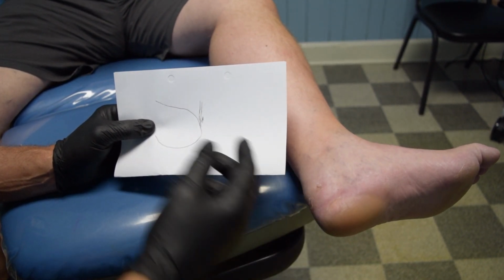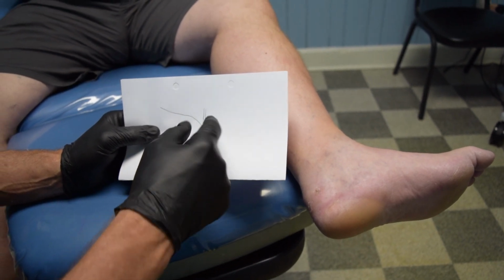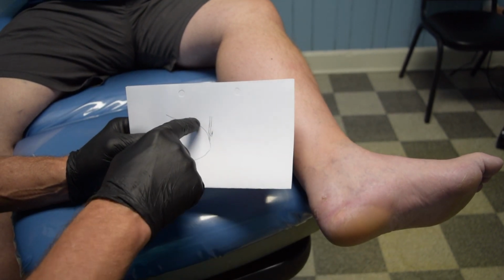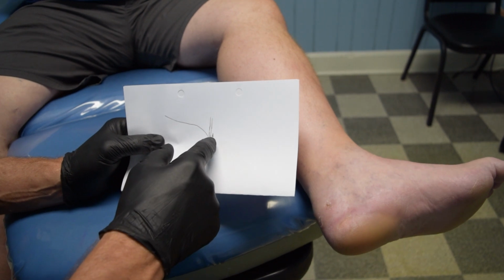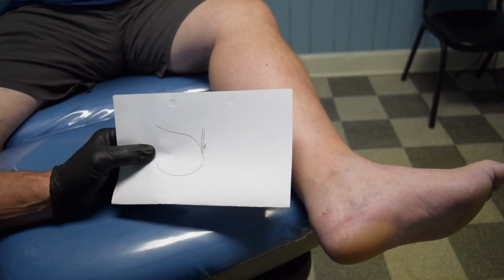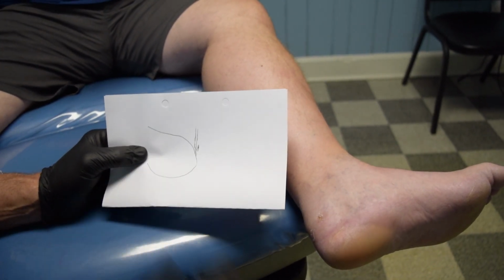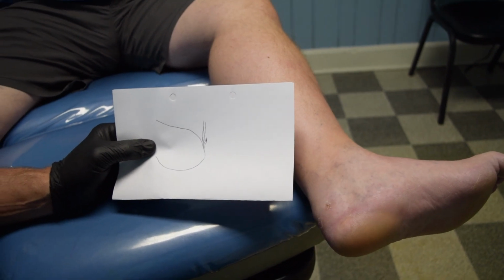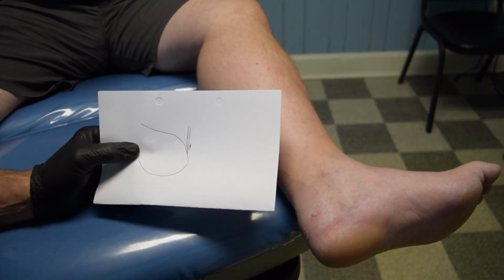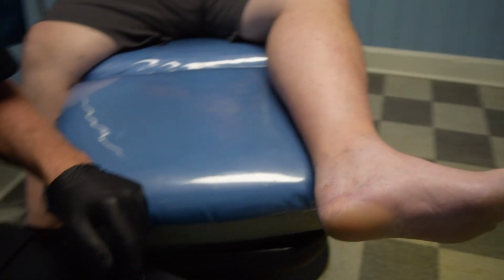And then what that will do, the spur will still be intratendinous, but it won't be attached to the bone, so basically it doesn't hurt. So we're removing the Haglund's deformity and freeing the spur from its attachments, and trying to get as much of that out as we can. But basically most patients are pain free with the procedure. So it allows us to do this without detaching the tendon, without excessive post-op recovery, which the traditional surgery does have.